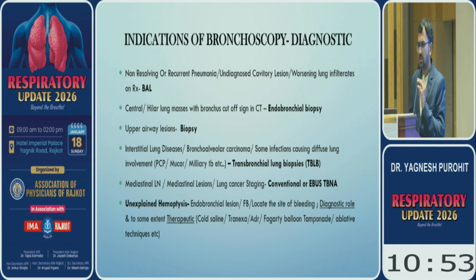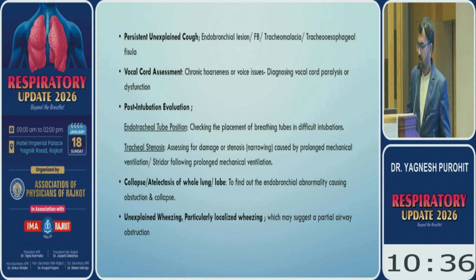Therapeutic purpose, it also has a limited role in hemoptysis. We can control the hemoptysis using cold saline or balloon tamponade. But in cases of massive hemoptysis, sometimes we don't have a vision, so it has a limited role in massive hemoptysis. And then in cases of persistent unexplained cough, there can be many endobronchial lesions or foreign body or tracheomalacia or any fistulas we can diagnose.